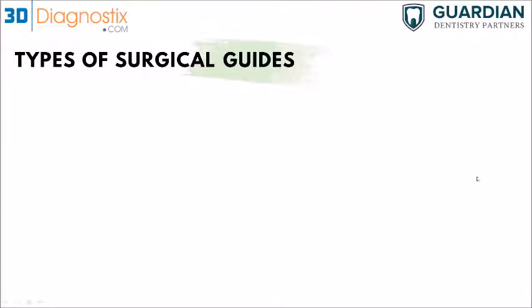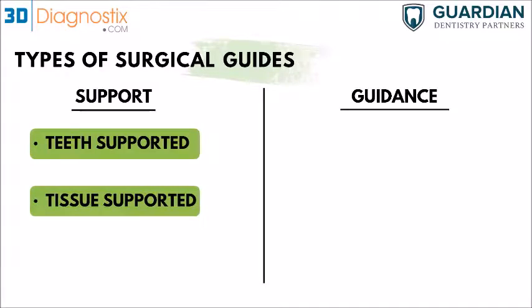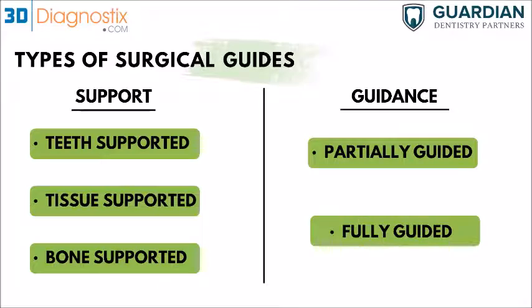Yep. So what are the types of the surgical guides we have to offer? I've divided them into support and guidance. So let's talk about support first. We've got 3 types of surgical guides: teeth supported, tissue supported, and bone. And then we're going to talk about the guidance. We've got partially guided and fully guided.